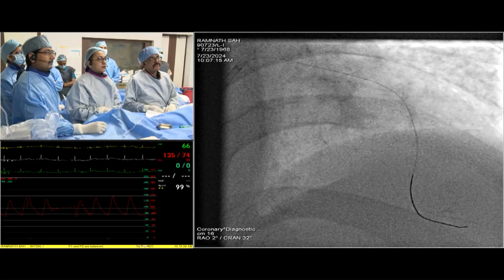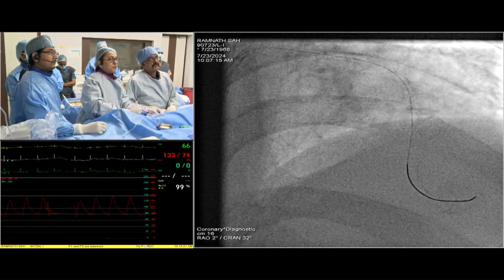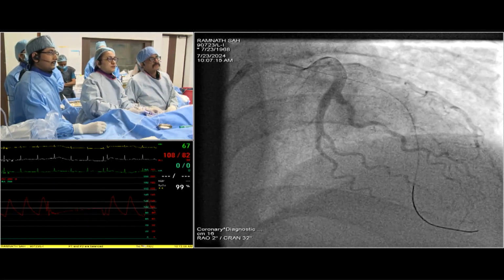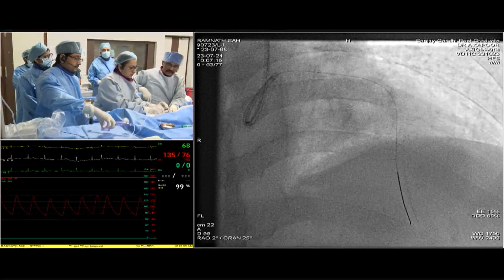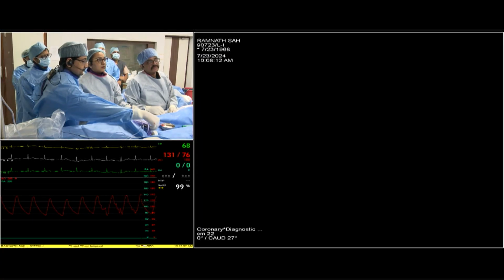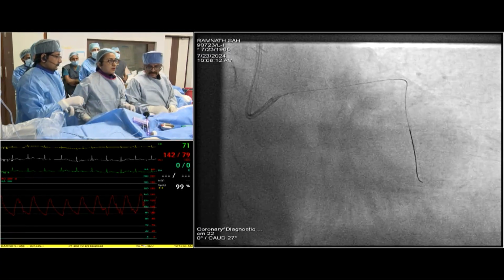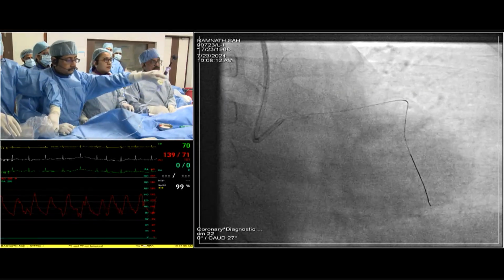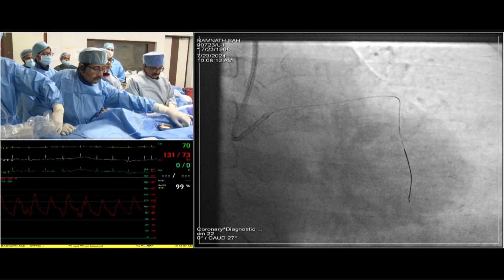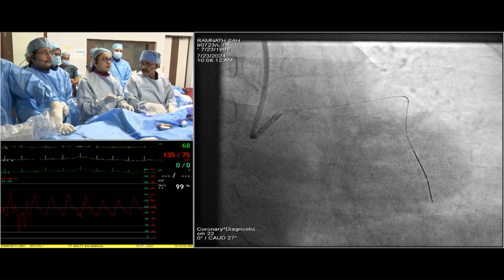Is there any forward flow? I doubt it. I think post wire, it would have decreased the flow. Yes, sir, as expected. So maybe you and Rupali can also run us through this: if somebody, just for discussion's sake, wants to say that I just want to do a thromboaspiration at this point of time, how relevant would that be, or shall we straight away go ahead with the balloon, as we are doing?